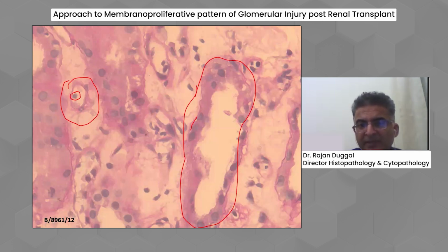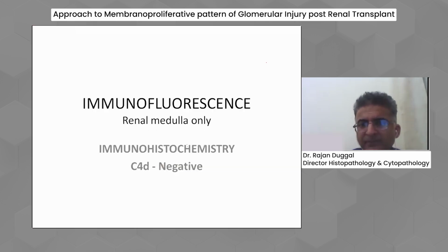Similarly, this is also a PTC. You can find one lymphocyte, a second lymphocyte here. Similarly, this is a PTC. You can find one, two, and possibly this is the endothelial cell. So there is some PTC capillaritis which is there.